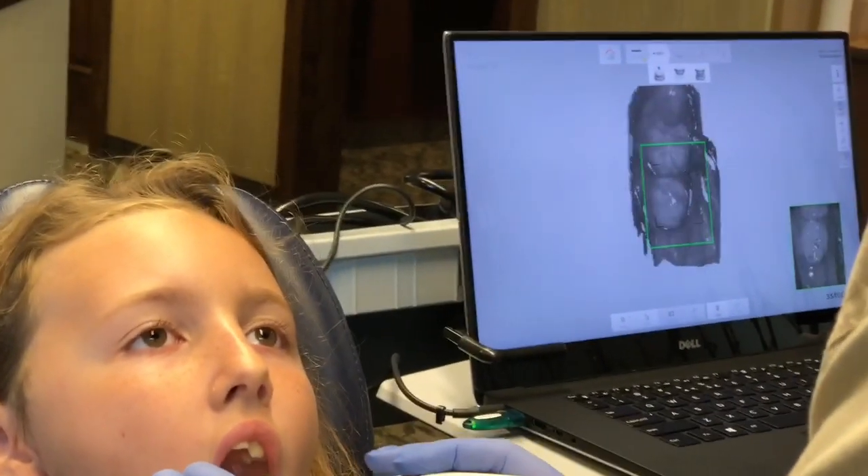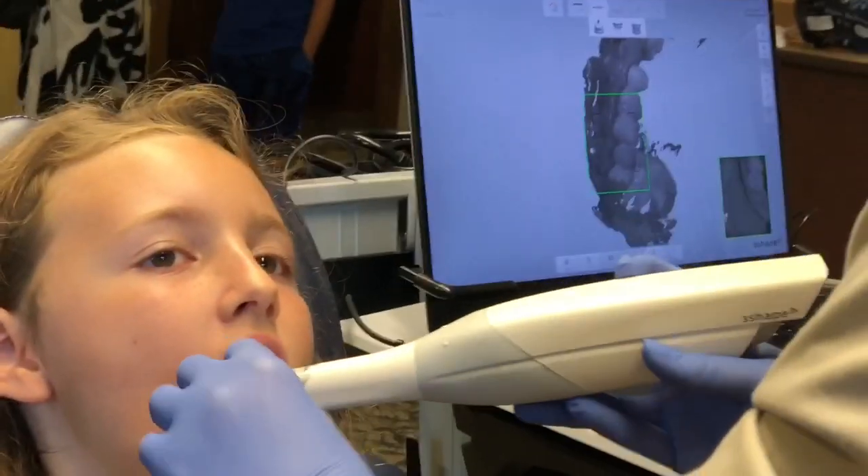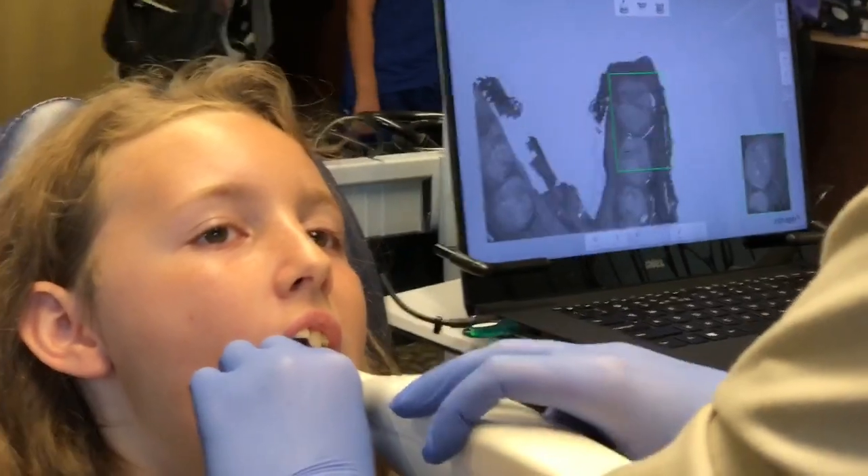What does this do? Take a picture? Yeah, it just takes a bunch of pictures and compiles them together. It's showing your teeth, and then this is where all the guys have had them back here.